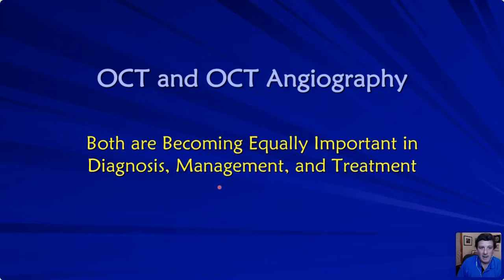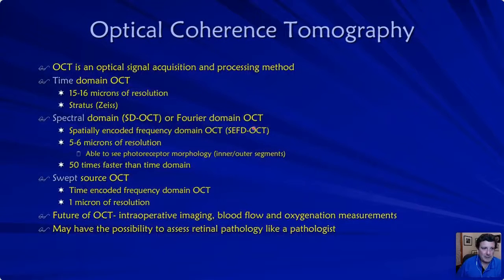You've been warned. So with that being said, optical coherence tomography. Time domain is about 15 to 16 microns of resolution.